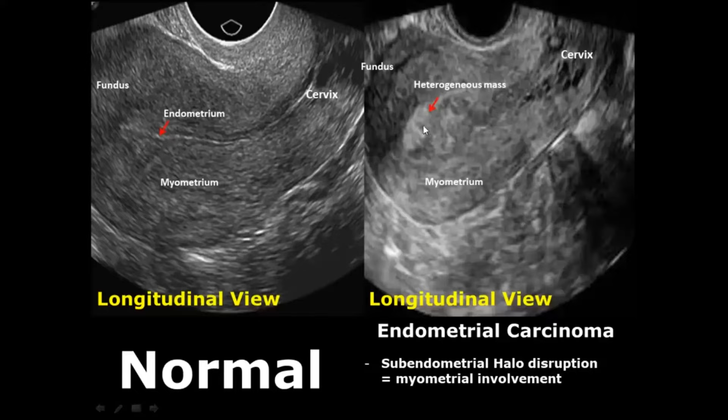In endometrial carcinoma, if there is disruption of this sub-endometrial halo, it leads to myometrial involvement, meaning the carcinoma has reached the myometrium.